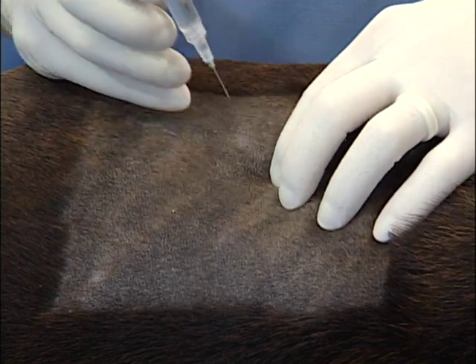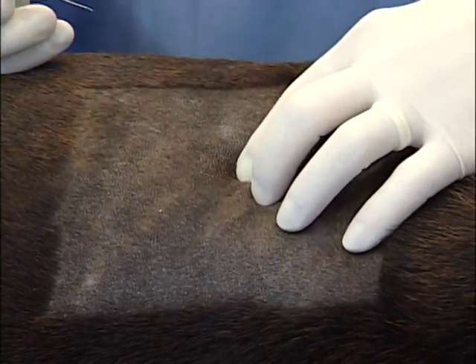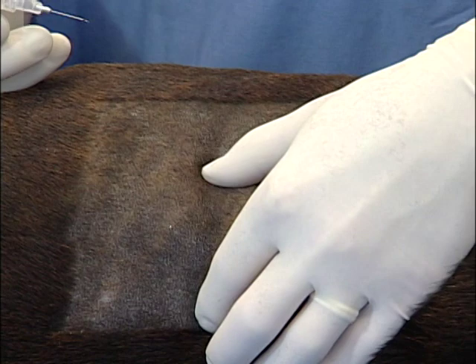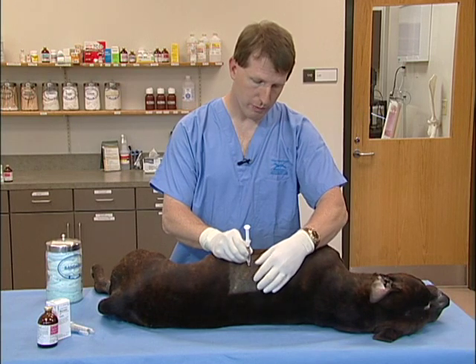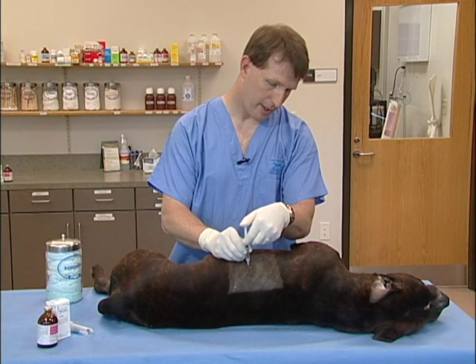Then we'll take the needle out. If we're blocking for a thoracotomy or for rib fracture, we want to block a couple of nerves on each side, so we'll do the same thing. We'll palpate again the dorsal processes, feel for the next rib caudal at the most proximal caudal aspect, insert our needle to the rib, aspirate, and then inject.